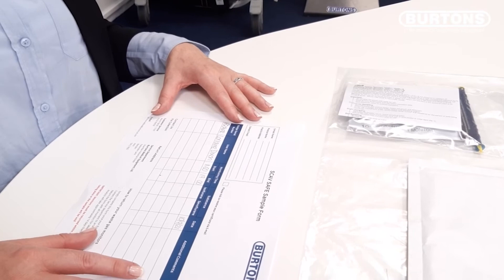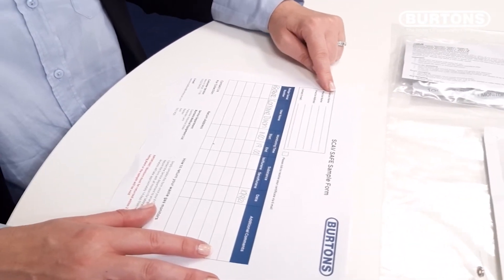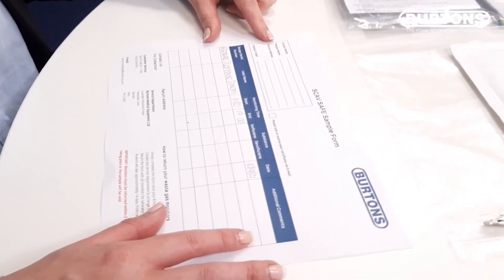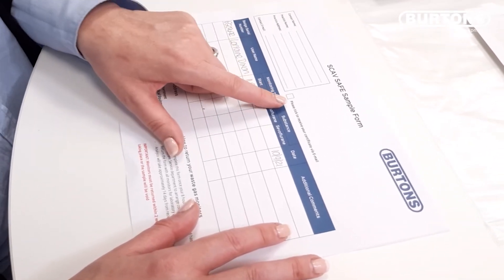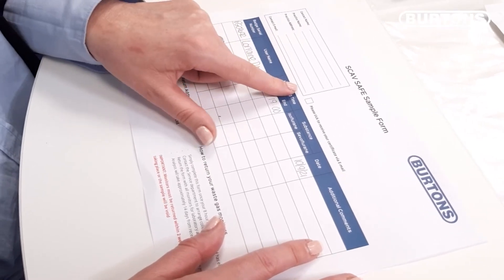Complete the remainder of your sampling form: the contact name, the practice name and address, and if you wish your certificates to be sent to you via email, an email address.